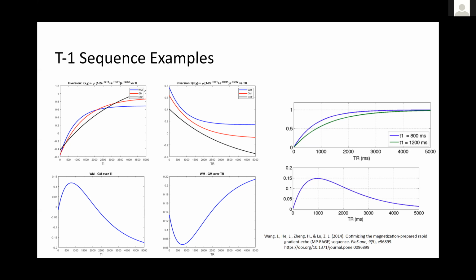The middle graphs show intensity versus TR. Longer TR times also result in higher contrast. The graphs on the right are from the presentation slides in lectures and show a typical T1 weighted sequence with no inversion. And as you can see, the contrast instead drops off over time.